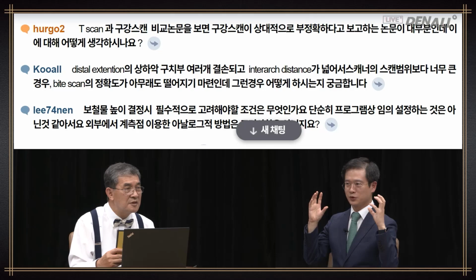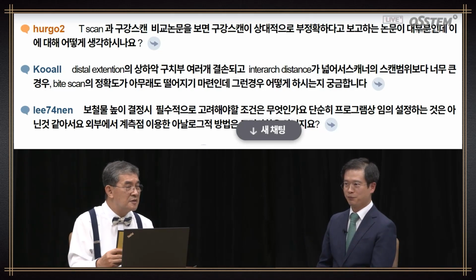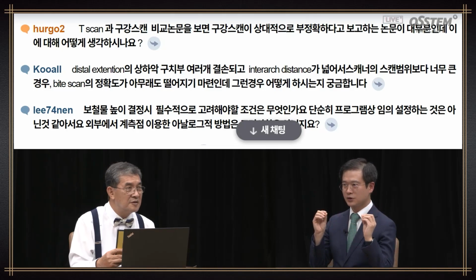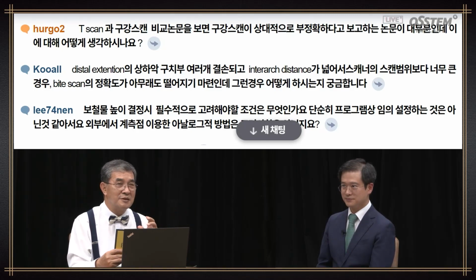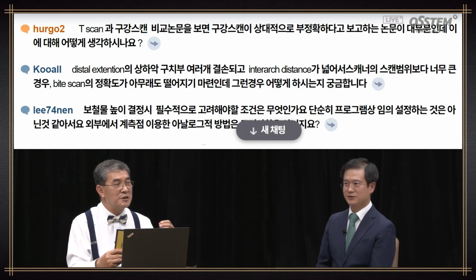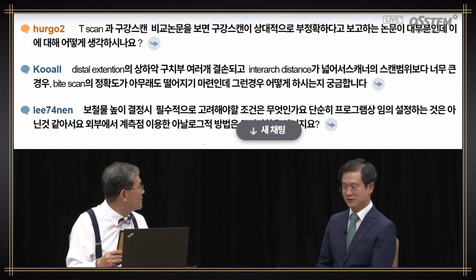In cases where that is not possible, like using the wax rim, I use a well-fitting temporary provisional. I scan that and get help from that. So you do not proceed just as is, but you use the provisional denture to get bite and movement. Temporary denture, or should I say provisional denture. You scan that to get the bite and movement.